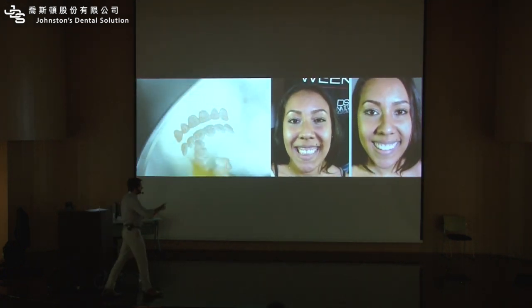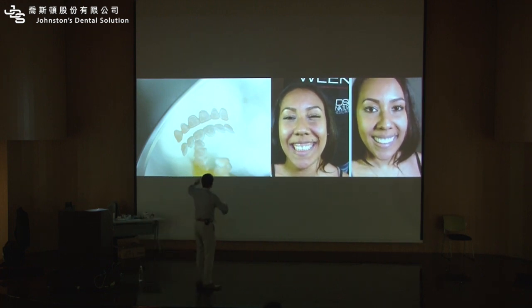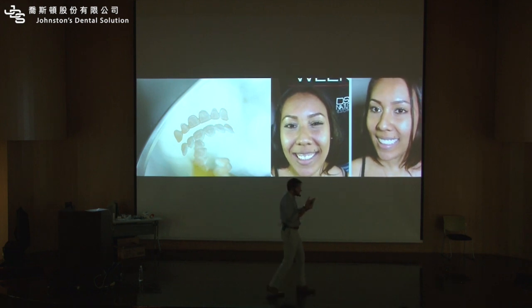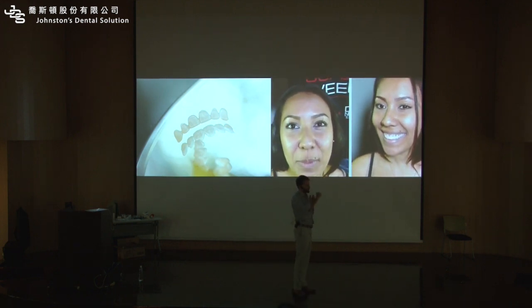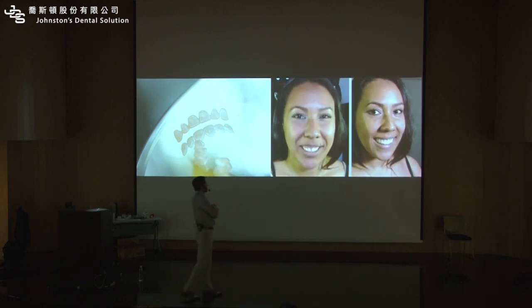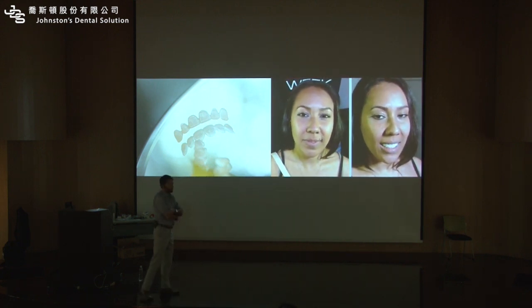So this is her with the mock-up. Without, look at the shells. We call it the shells. Okay? So this one is over her gum, simulating the crown lengthening procedure. Okay? How it may look after crown lengthening.